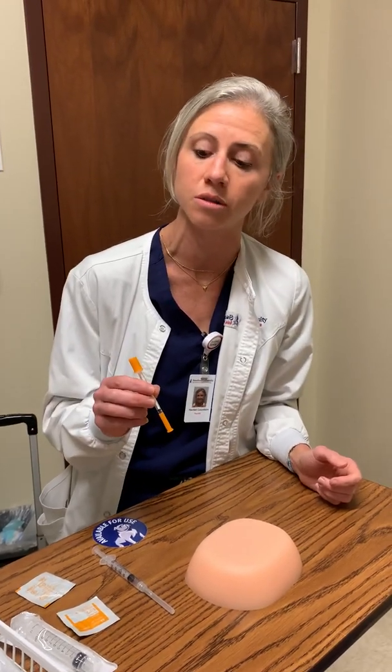So that when we're going in to give our injection to the patient, make sure that you know the angle your needle is supposed to be at, and be comfortable with that when you're going in, okay? With the subcutaneous injection, we need to make sure that we're getting that skin. We're gonna be pinching some skin together, okay? So my hands are gloved. I'm gonna get my skin together.